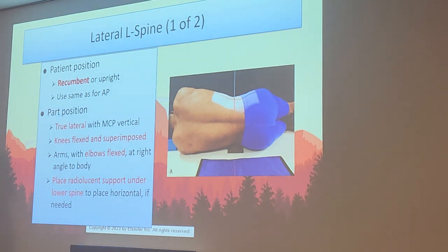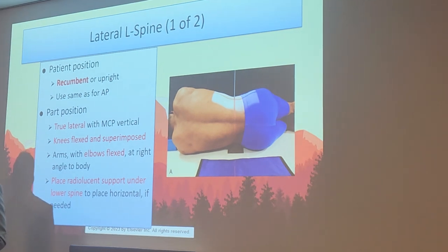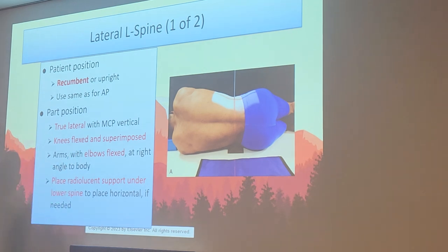Now, we're going to make sure the patient is in a true lateral. It actually can be more difficult to get that true lateral than I realized. All of you positioned this in lab this week. I'm sure your teachers showed you how important it is to check the top and the bottom. Make sure the shoulders are superimposed and also the hips are superimposed, because very easily, because of shifting weight, just because the shoulders look straight, I might walk down and their hips are shifted. Or I might have the hips just right, I walk around the top and the shoulders are shifted. If we're not on the same plane, that spine's going to end up curved.